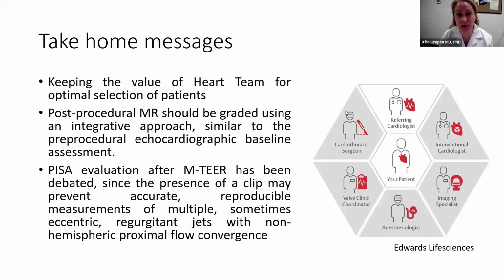The post-procedural mitral regurgitation should be graded using an integrative approach, and it's important that it be similar to the pre-procedural echocardiographic baseline assessment. That may sound repetitive, but using the same protocol will save you from mistakes. And of course, post-procedural assessment is challenging. However, a good echocardiographer will give precise information about the nature of the jets, the residual jets, and the severity. And of course, hemodynamics are an important step in guiding further management of this patient.